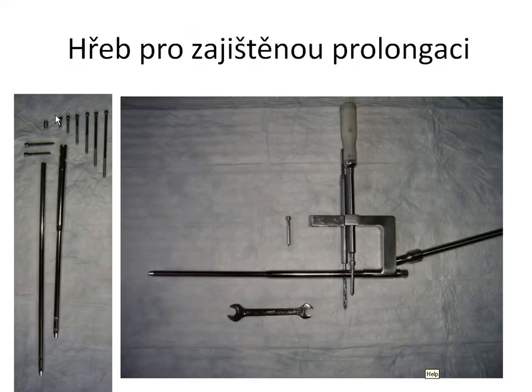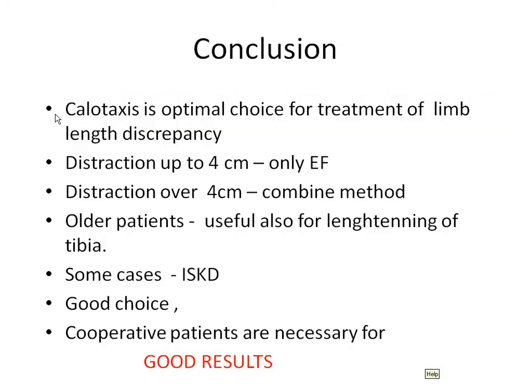Here you can see the bending and then the straightening after the anesthesia. We developed, with people from Czech factories, a nail for this locking lengthening nail, which we can lock from this side. We don't need X-ray to lock it distally, so it's quite simple.